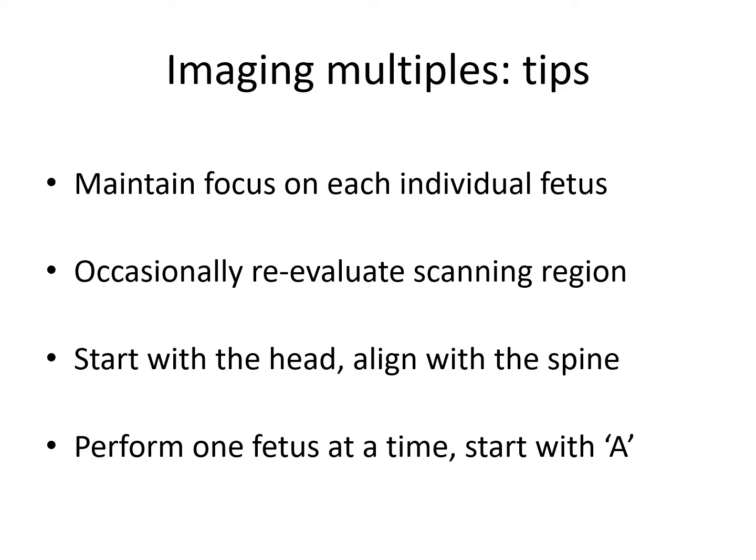And once more, you perform one fetus at a time, and you start with the first fetus, which is A, the closest fetus to the cervix, and then you complete the full study on that fetus before moving to your next fetus.